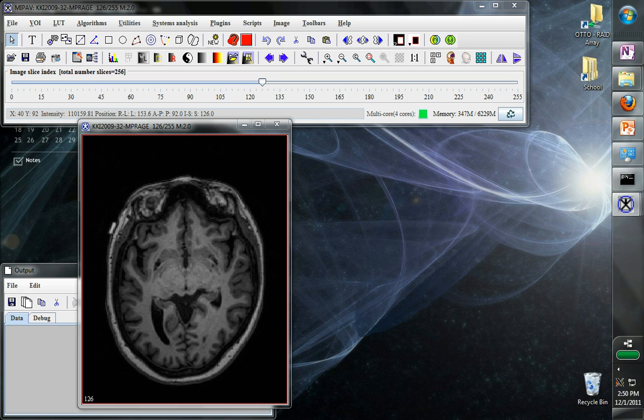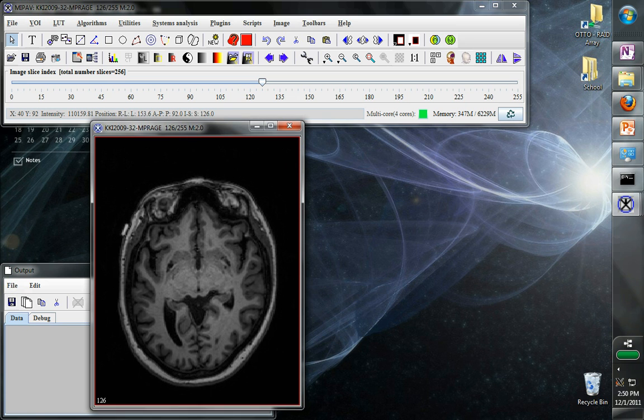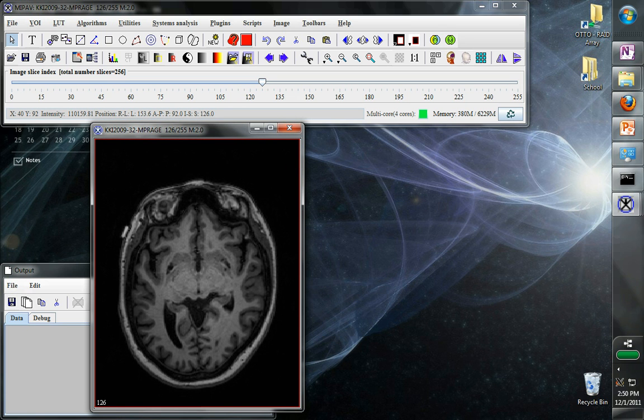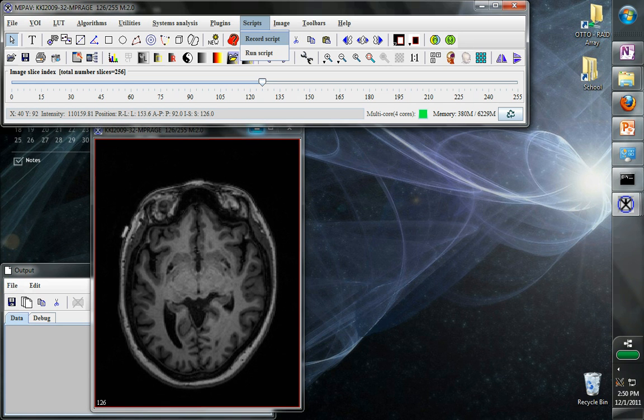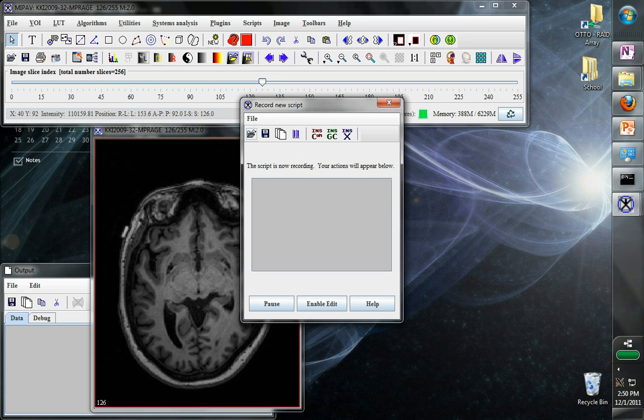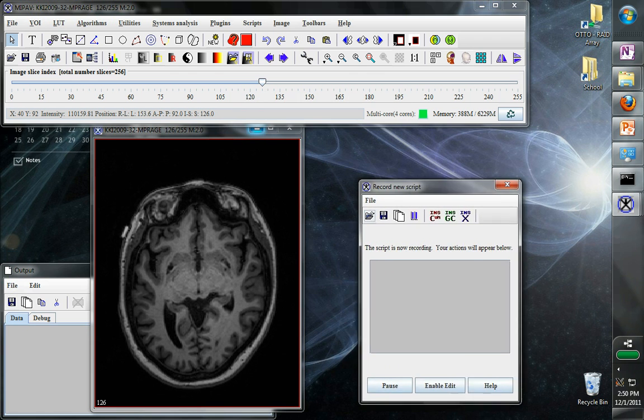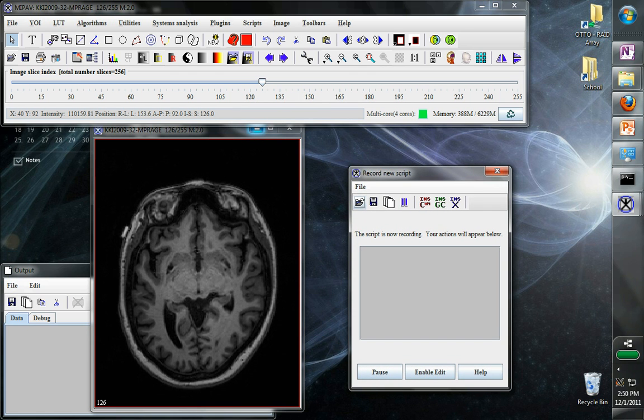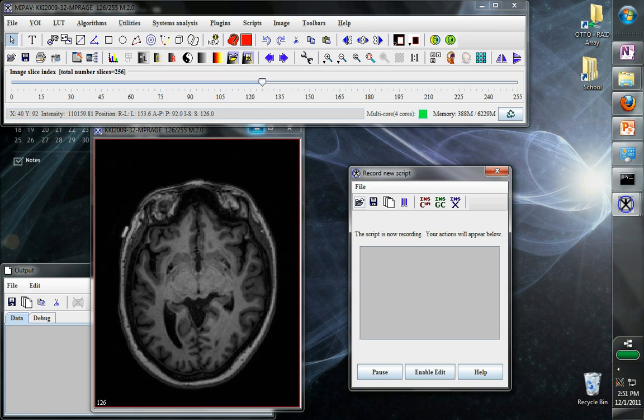Here is a T1-weighted image. We want to blur this and then save it in another format. So we can go to scripts and hit record script. Now we bring up this little script recorder dialog box. This is helpful because now MiPav is watching what we're doing and it will even know what steps we go through in order for it to be able to apply it to different images.